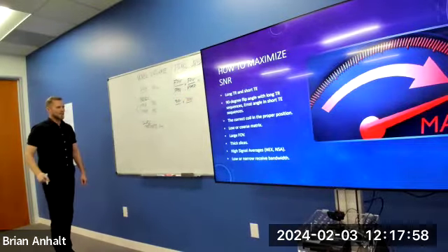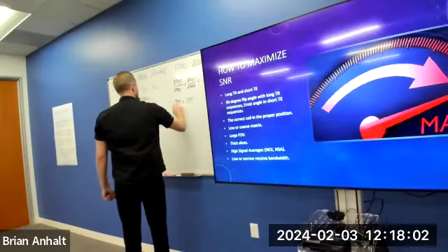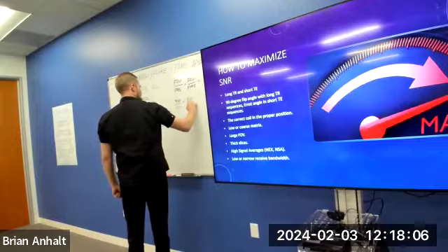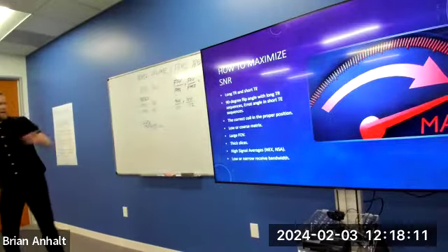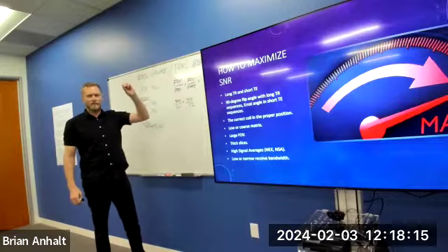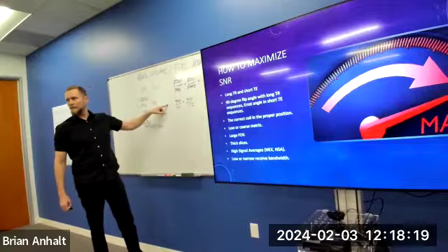Frequency, what's my frequency number? 320. And my phase number is 192. Right here, the answer to both of these is going to give me the dimension of the pixel in each different direction. So could somebody pull out a calculator and give me the answer here?